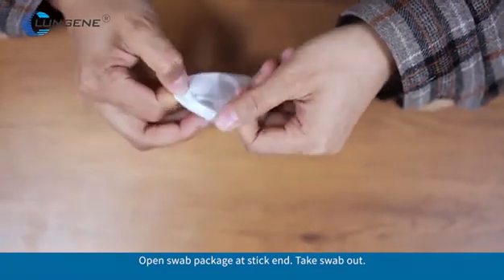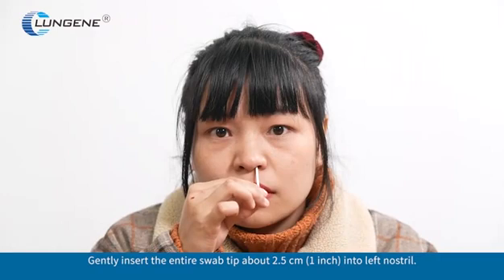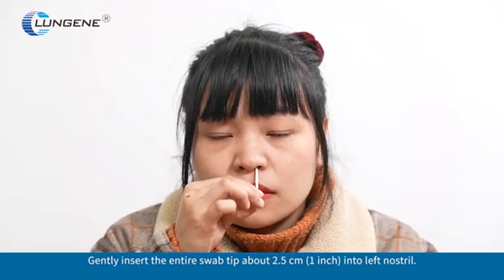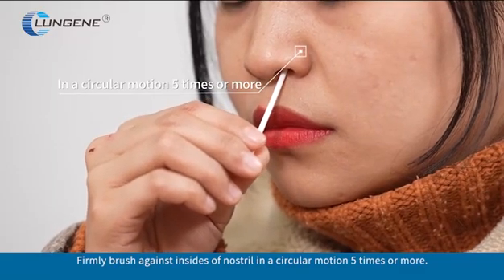Open the swab package at the thick end and take the swab out. Gently insert the entire swab tip about 2.5 cm (1 inch) into the left nostril. Firmly brush against the insides of the nostril in a circular motion 5 times or more.